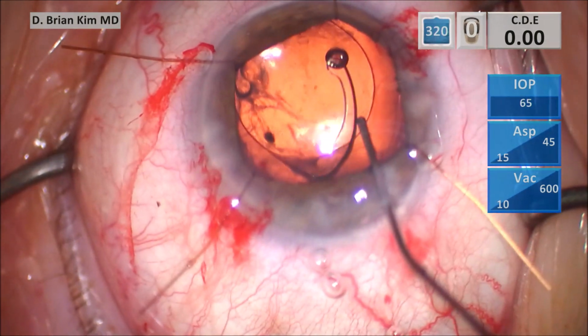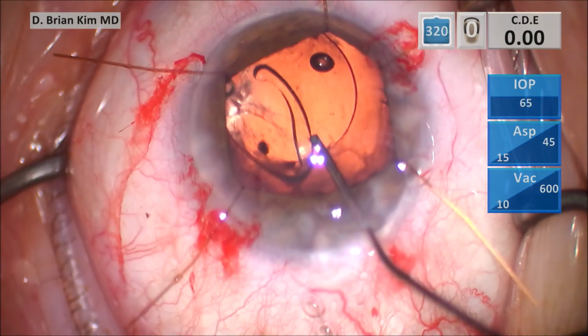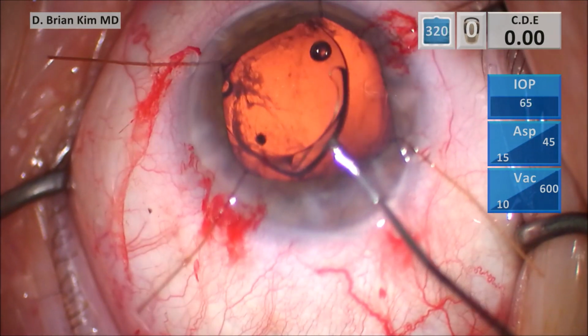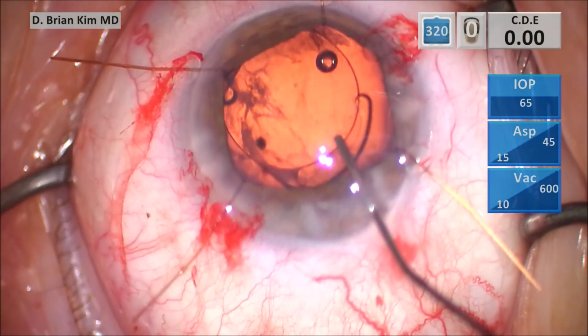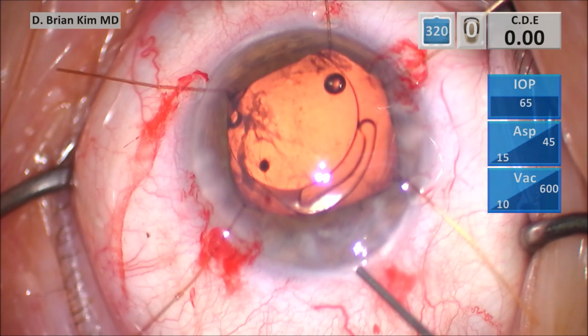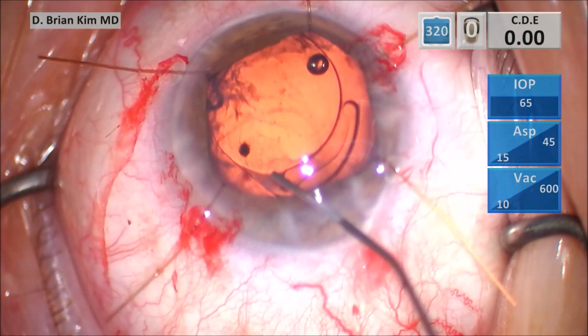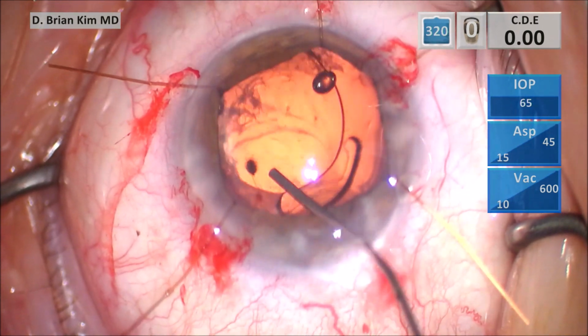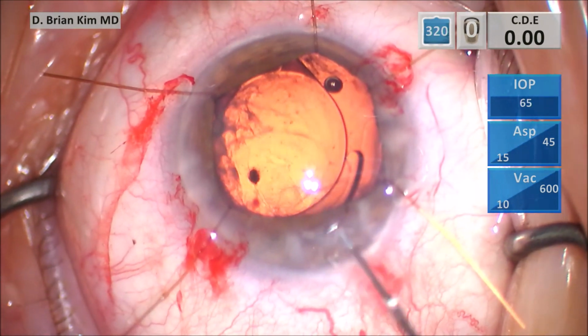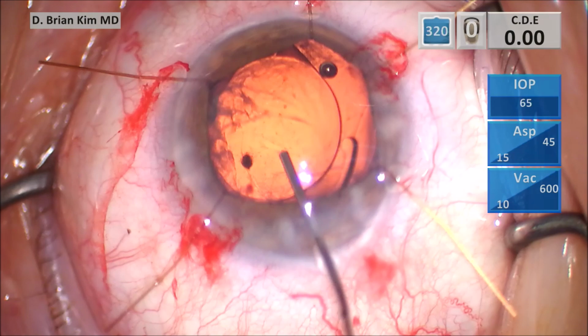But for the same reasons, for this type of situation where I have good anterior and posterior capsule, but I have a localized anterior capsule tear, I can position the haptics perpendicular to that tear, and I should be in good shape. And so I was able to tuck the haptics accordingly and basically position the haptics away from the tear.